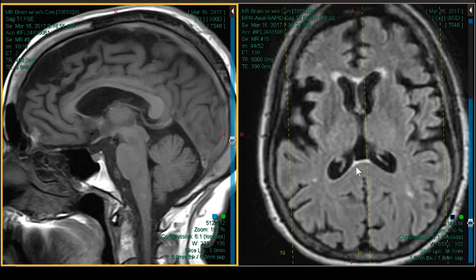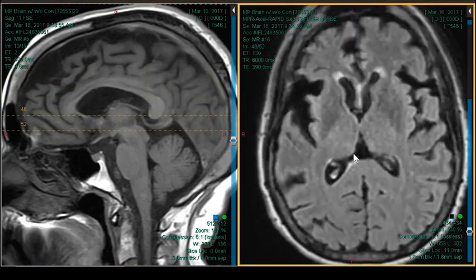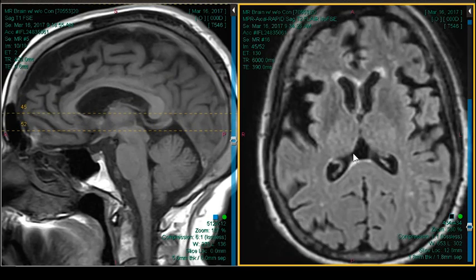So ventricular size, a little big, but there's no sulcal effacement. Okay, there's no transependymal spread. So I'll make that comment, address that concern that they have, so they can move forward.